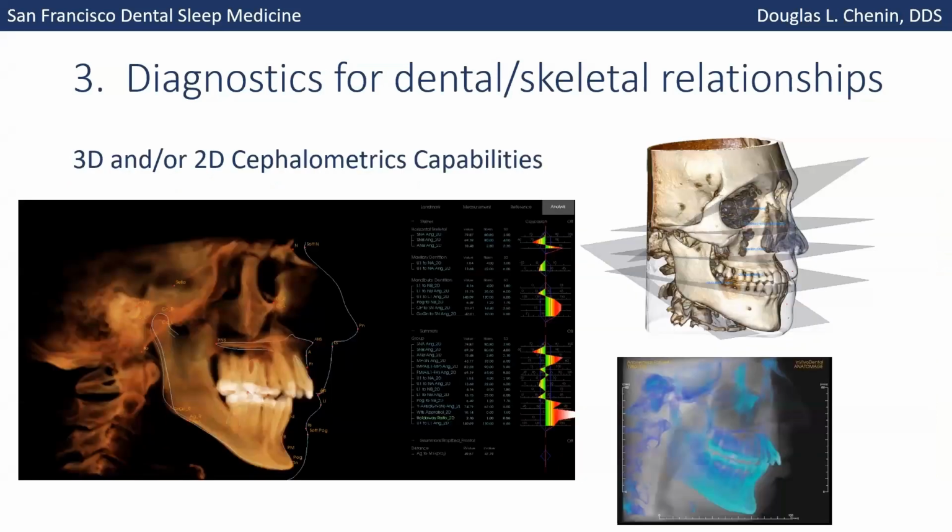You can get into really advanced cephalometric analyses, which is really neat now with the AI auto one. This is super easy. You just press the button and it traces for you. And so it is kind of neat to get those values and numbers for the skeletal relationships. Again, because I see a lot of children and adults who were treated orthodontically, and they come in presenting as class 1 occlusion and bites, but skeletally they are not.